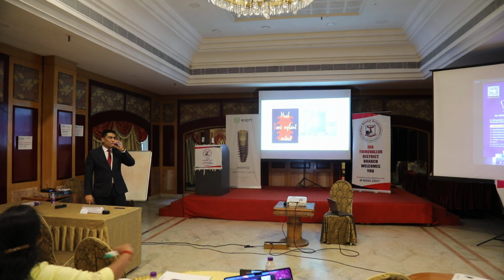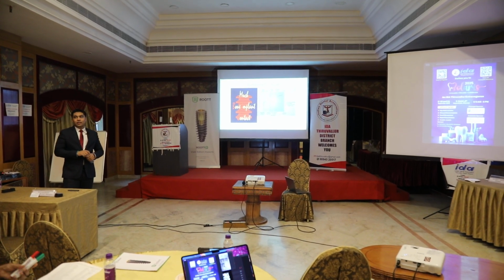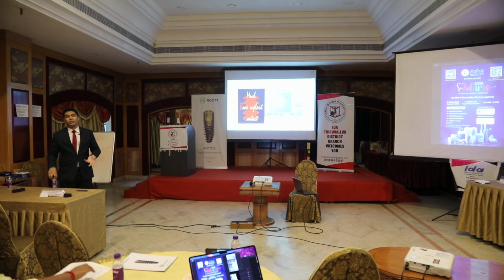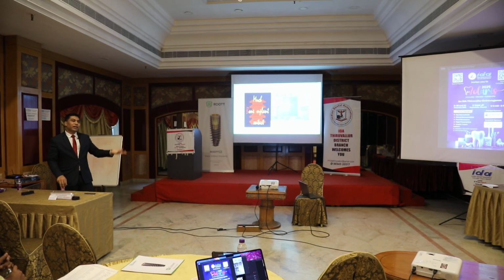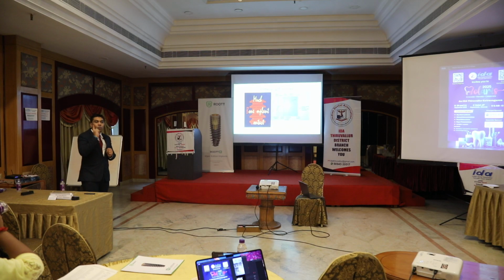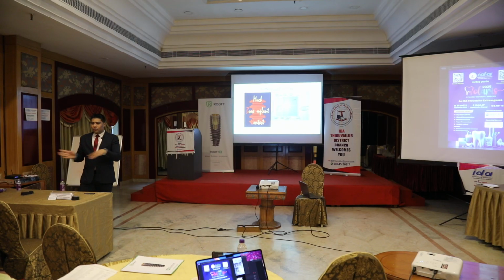Flapless procedures nowadays, is it flapless? You need to be prepared when you're doing flapless. You have to do completely guided if you go flapless, or at least pilot guided surgery. Because if you don't, implants will only give you one chance when you're drilling. There are no second chances in implants. If you go wrong with the pilot drill, there is no coming back.